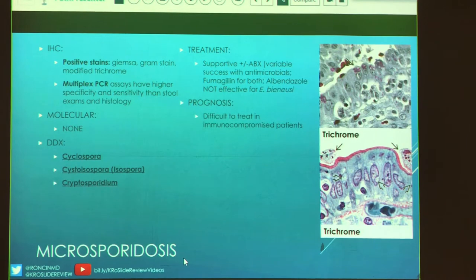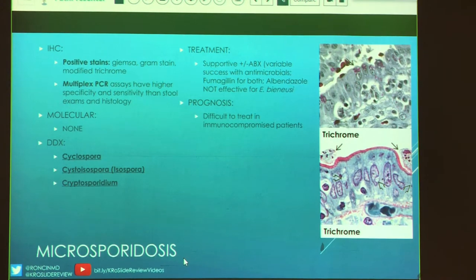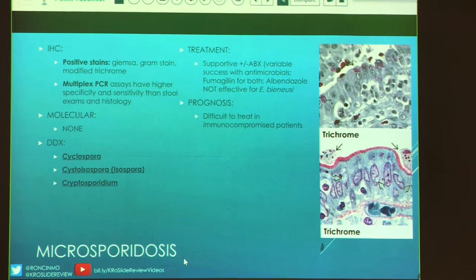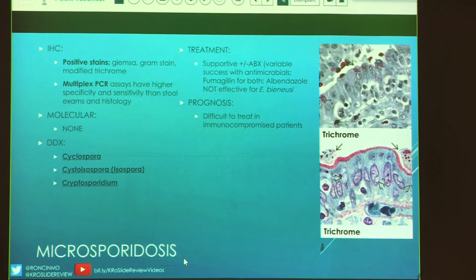The differential for microsporidia is mostly other infectious organisms: cyclospora, isospora, and cryptosporidium. Treatment is mostly supportive. Fumagillin can be used for both types of infection, but albendazole will not be effective for E. bieneusi. Immunocompromised patients are very difficult to treat. Both pictures on this slide are trichrome stains, showing how nicely they highlight the organisms and spores.